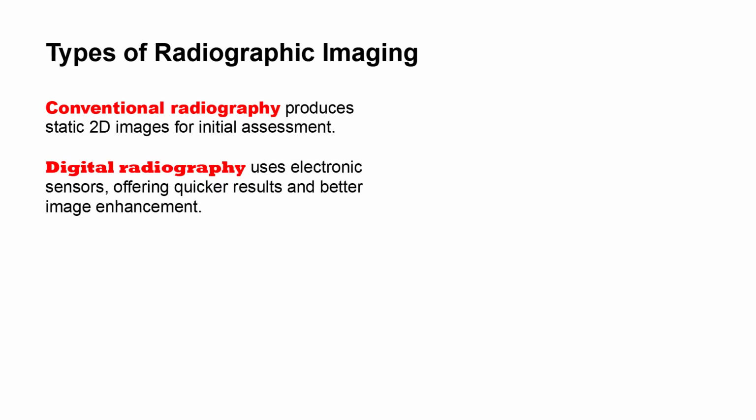And then, of course, we have digital radiography, which uses electronic sensors, offering quicker results and better image enhancement.